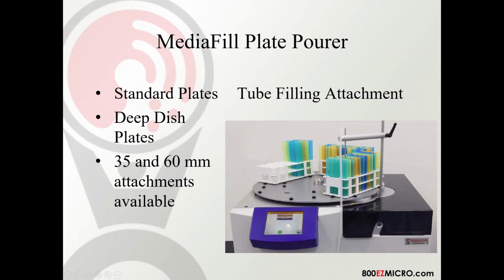So the MediaFill plate pour allows you to do standard plates, the deep dish, 35 and 60 millimeter attachments are available, as well as the tube filling attachment that we showed during the demonstration.